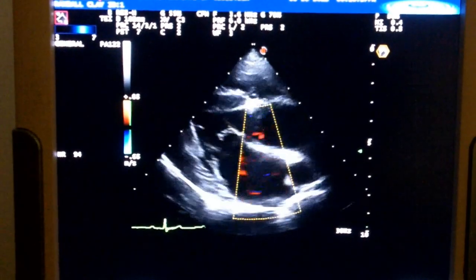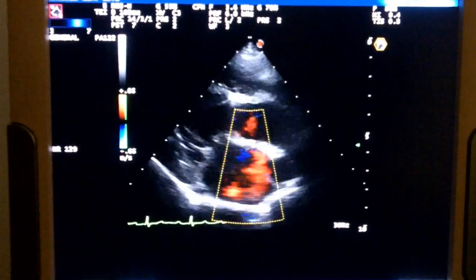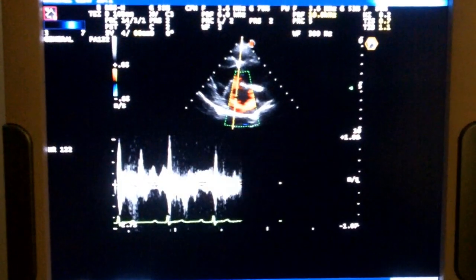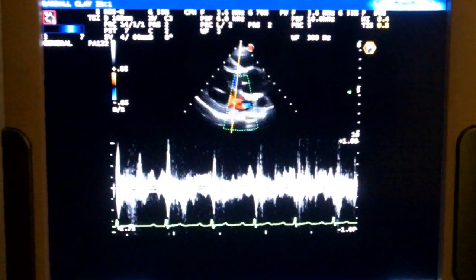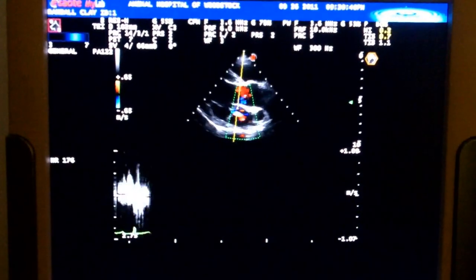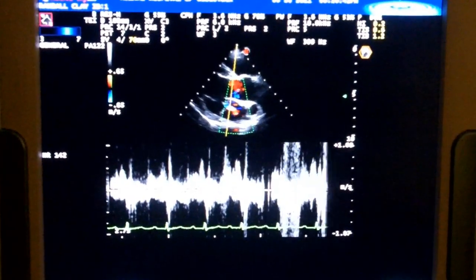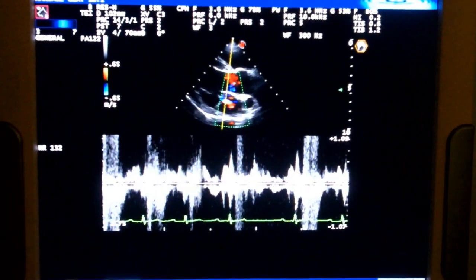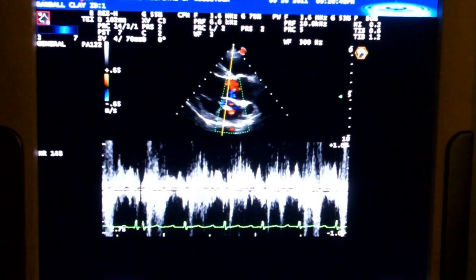And you can see it pretty clearly there. So we should be able to get that to come in here. We'll put a pulse wave Doppler on it. So you can hear it and also see it.